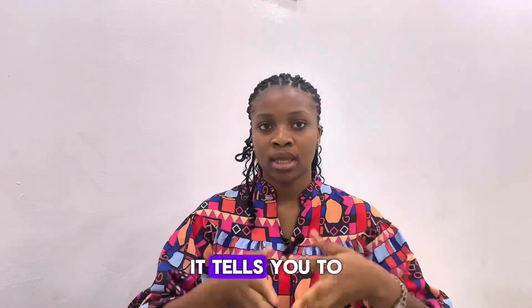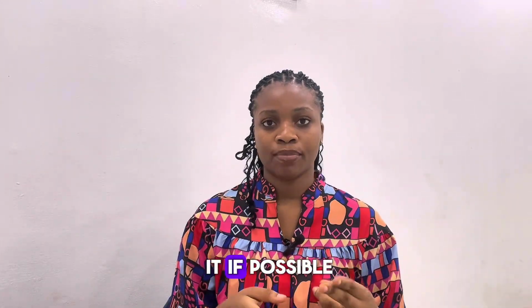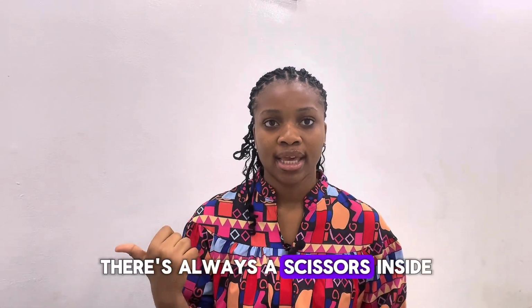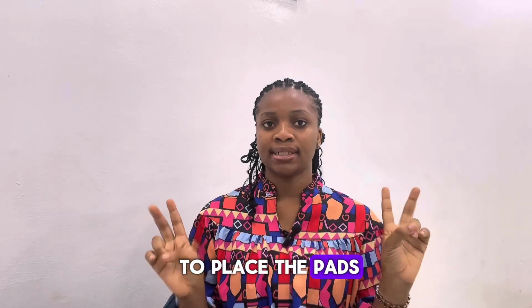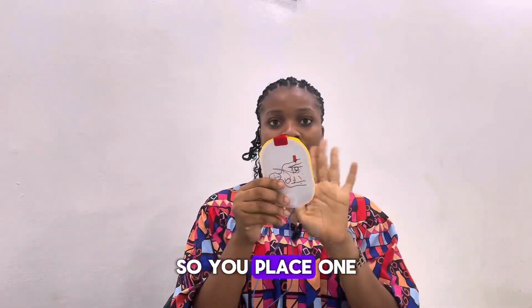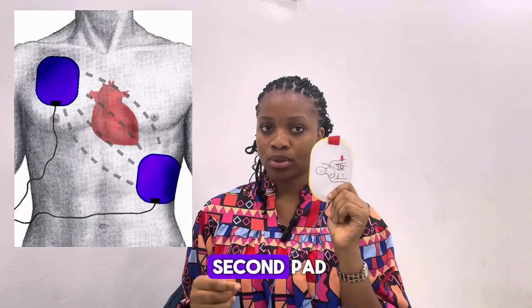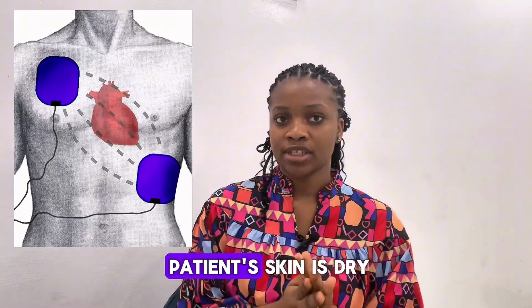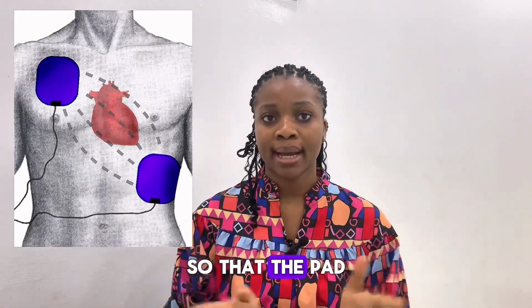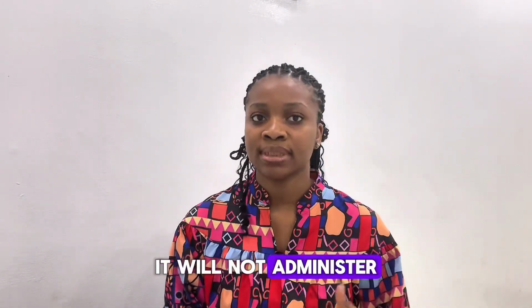When you turn it on, it tells you to remove patient clothing and you can cut it if possible. There's always a scissors inside so you can cut the clothes. After that, you have to place the pads. There are two pads, so you place one pad at the upper right chest and the second pad you place at the lower left side. Make sure that the patient's skin is dry so that the pad can stick properly, because if it doesn't stick properly, it will not administer a shock.